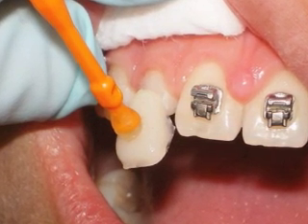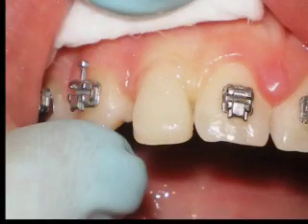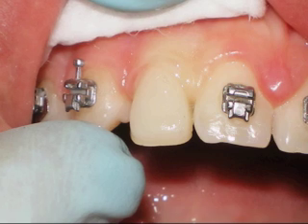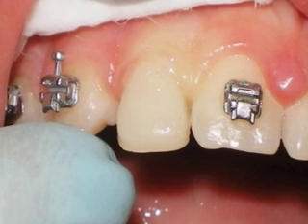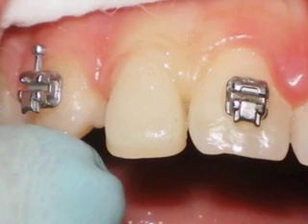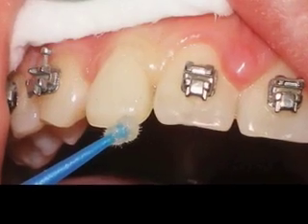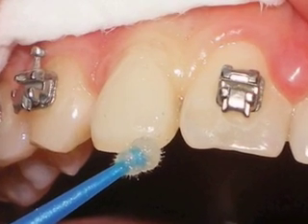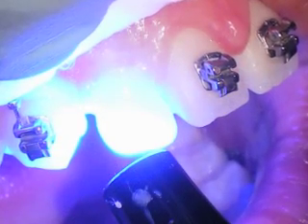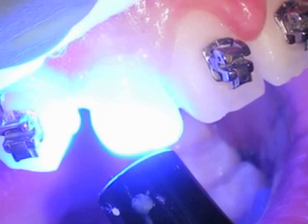I press and ideally position the face-o-form and remove the sticky wand with a twisting motion. At this point, I will use my finger to gently roll the excess composite over the lingual surface — that's where a lot of the retention comes from. I again use a sealant-covered pledget to smooth and remove excess composite, being careful not to disturb the ideally positioned labial surface of the veneer. The entire complex is then cured, labial and lingual, for 10 to 15 seconds.